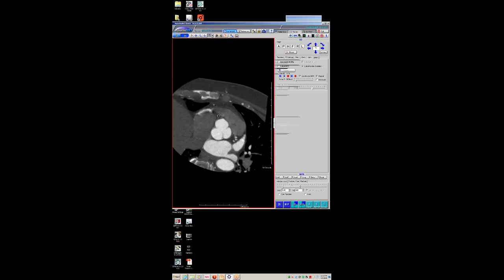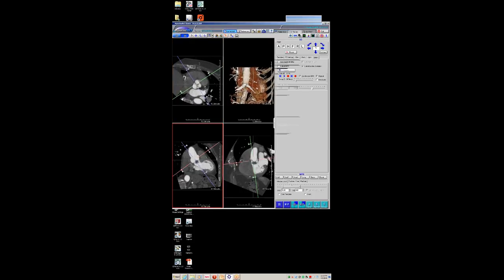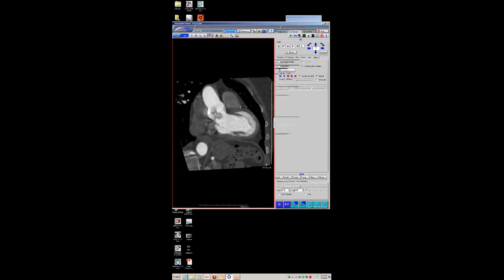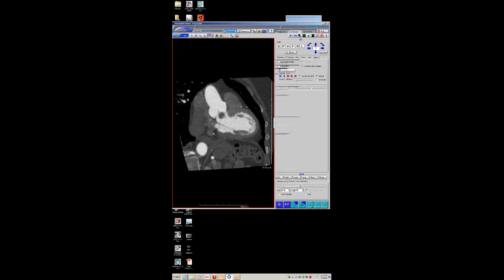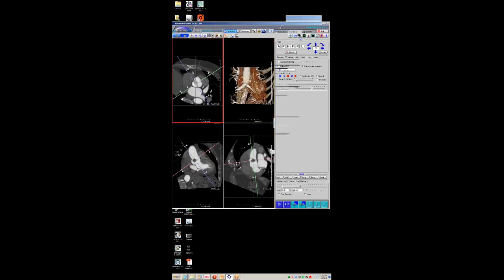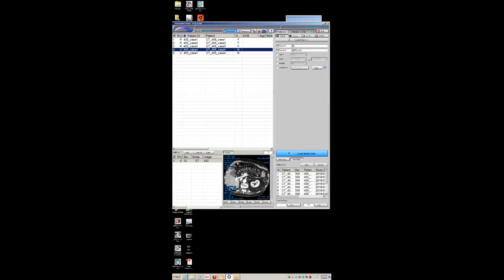Other things to differentiate: the valve is not destroyed. Endocarditis destroys valves, thickens valves, really makes them look quite ugly. So if you have a lesion on a valve and the valve otherwise looks unremarkable, and there's no history to suggest otherwise — people with endocarditis are usually also clinically very different. I'm surprised she didn't embolize and have some issues given how long that was on her valve.